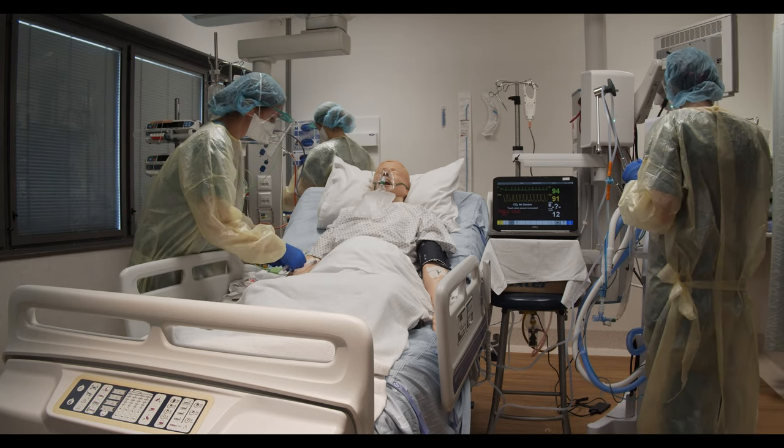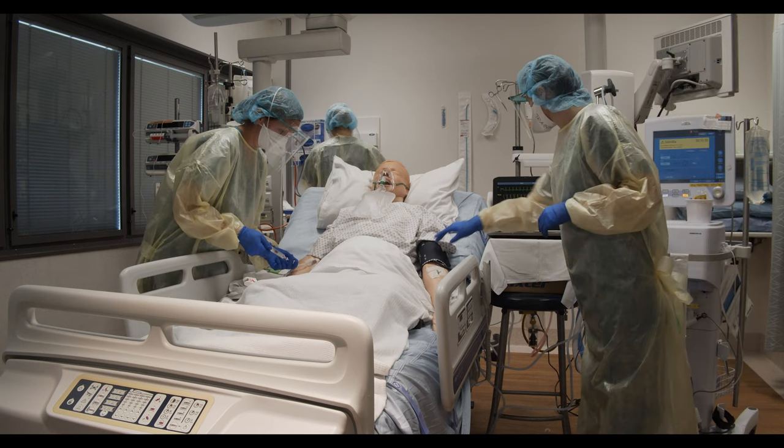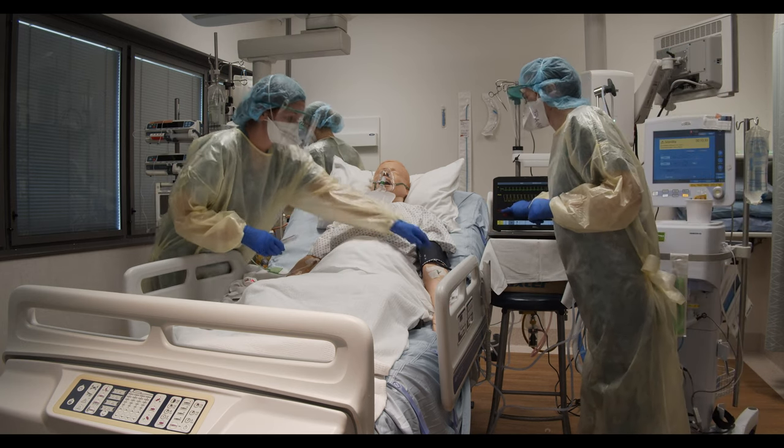First of all, I'm just going to check that these arms are working. You're just going to feel me squeezing on your arm again. It's going to go up a little bit more frequently now.